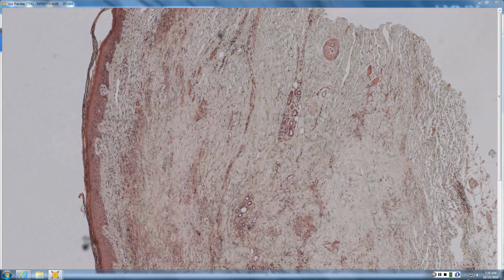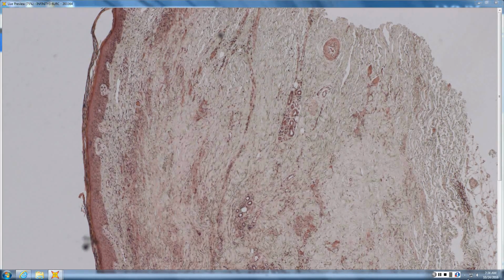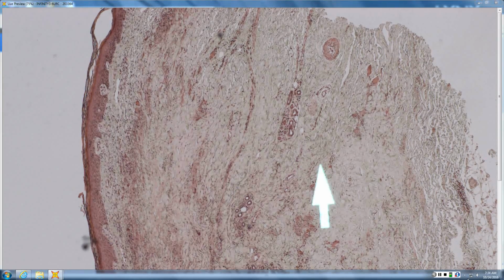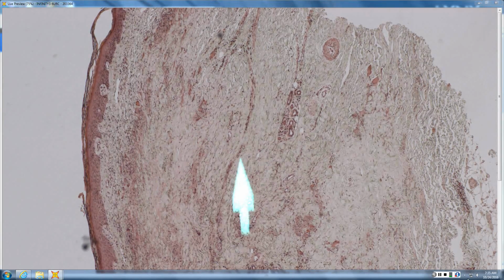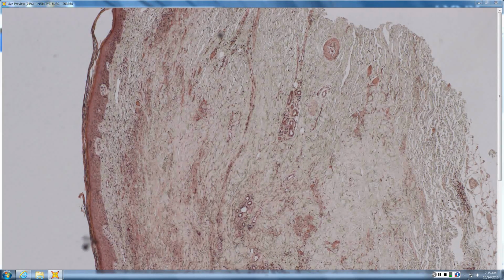If you look at the process, does it appear patchy and focal, or does it appear to go kind of side to side? Sort of side to side, top to bottom. Side to side is more likely which of the two? Necrobiosis lipoidica. So, you got yourself into a palisaded necrobiotic granuloma differential, which is pretty good. The dermis is kind of really faded looking, which goes more with NLD than with GA, where the changes are more focal. And you correctly said it's more side to side, top to bottom, which is more NLD than GA.